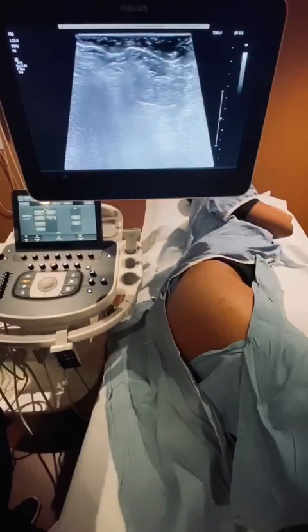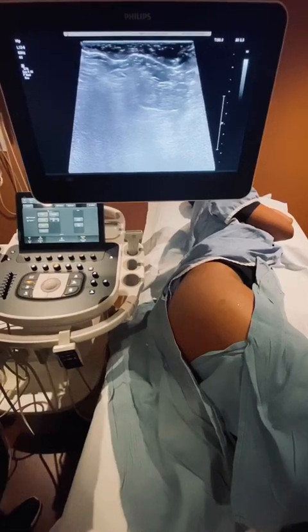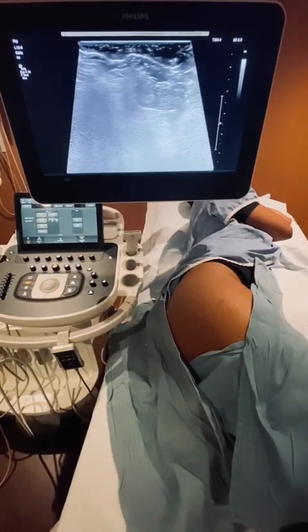Good morning, everyone. This is Jamie from Learnimus Caesano. Today I'm going to give you a tutorial on how to scan the gluteus minimus and medius tendons of the lateral hip. The first thing you're going to do is roll your patient into a decubitus position. In this case, I'm going to demonstrate on the patient's right hip.